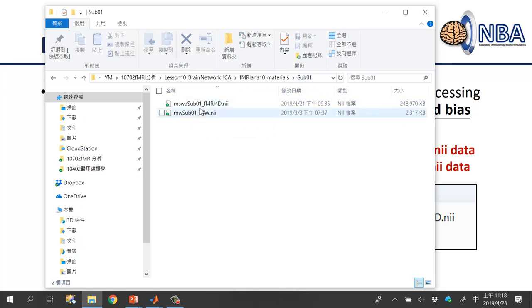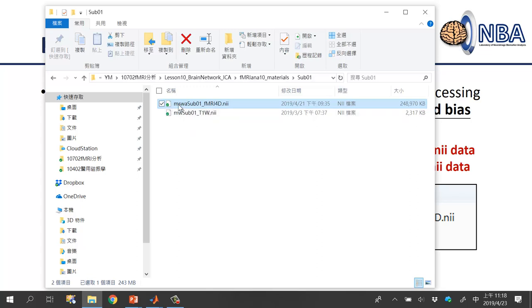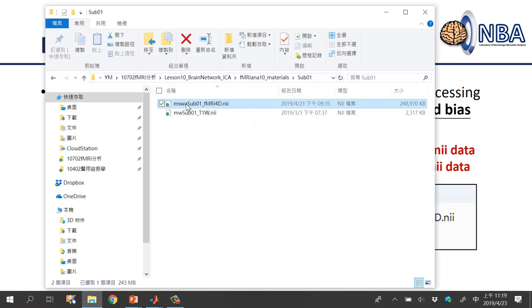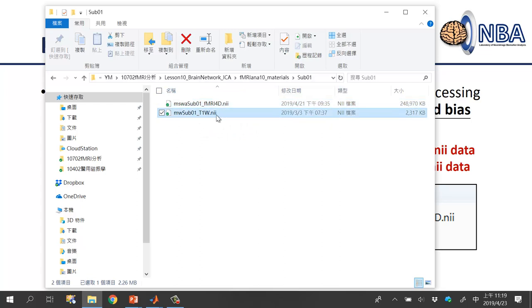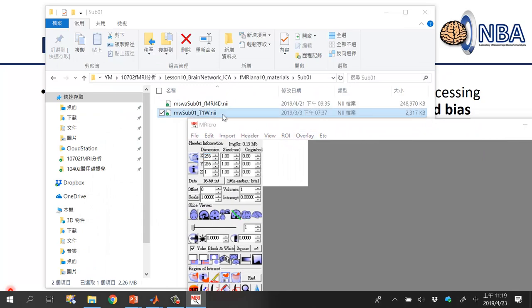Inside sub01, there are two files: a large one around 250 MB with the filename starting with 'mswra', indicating bias correction, smoothing, normalization, and realignment have all been performed. The T1-weighted file is around 2 MB, also bias-corrected and normalized, starting with 'm' and 'w'.